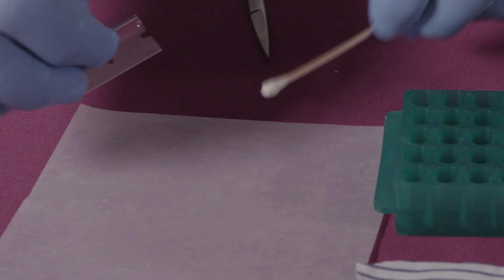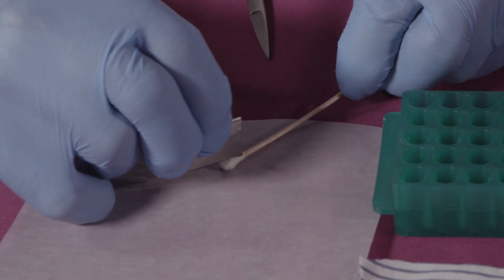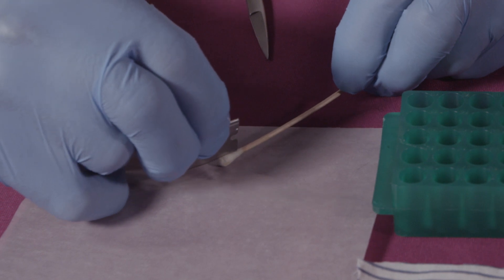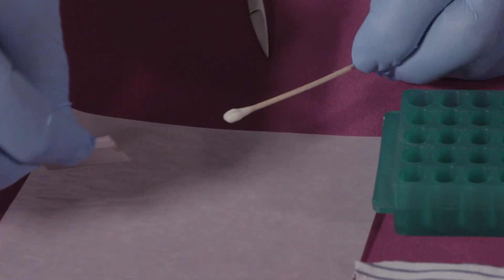If analyzing a body swab, slice longitudinally one quarter from the swab using a scalpel or razor blade and place inside a clean microfuge tube and label.